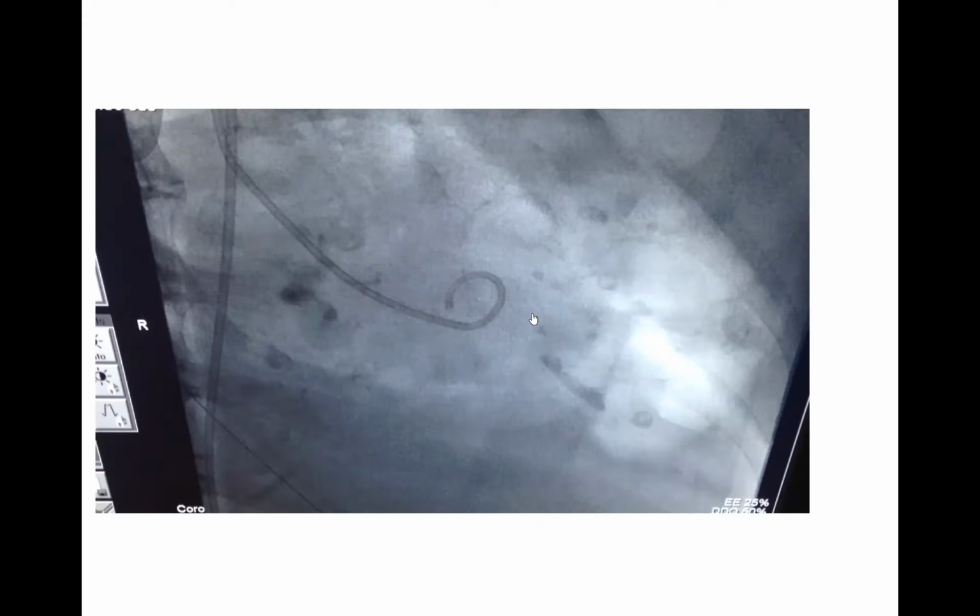That will give you a 6 French sheath in the aortic arch and a 4 French in the LV. The gap between 6 French and 4 French allows you to have a very good aortic pressure measurement. And the 4 French LV catheter gives you a good LV measurement. So that's the modality that I like as well. The caveat is you need to do it from the groin in order to do that. Okay, so those are the 2 ways of doing it.